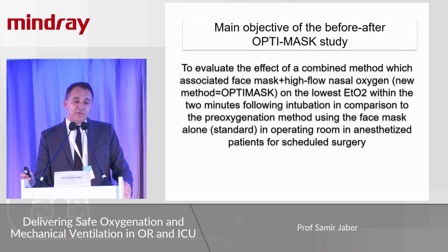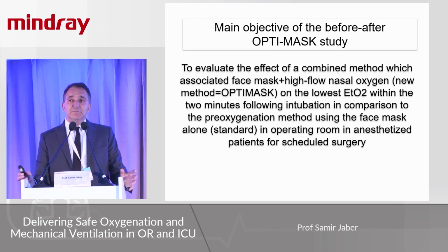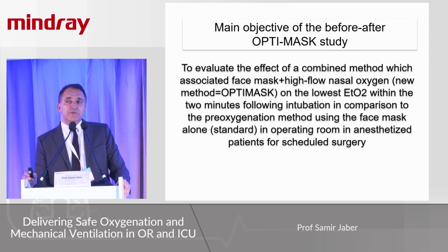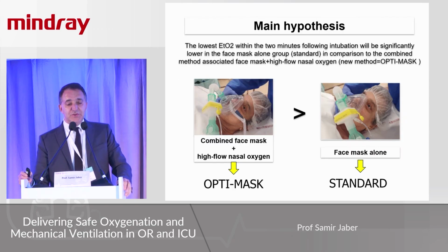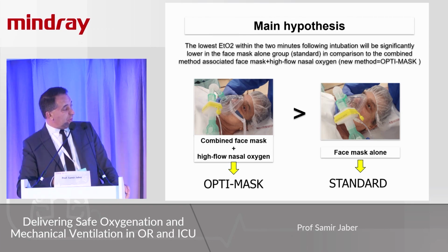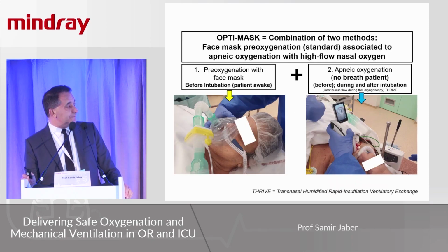The main objective of this before-after international study was to evaluate if the OptiMask strategy, a new one, compared to the standard one, could improve the oxygenation. We used for this study a surrogate of the oxygen quality, which is the lowest end-tidal oxygen after intubation. This is a surrogate of how the oxygen could be used in the lung of the patient. As you see here, the main hypothesis is the new technique OptiMask, the association of both, could be better in comparison to this oxygen standard alone.